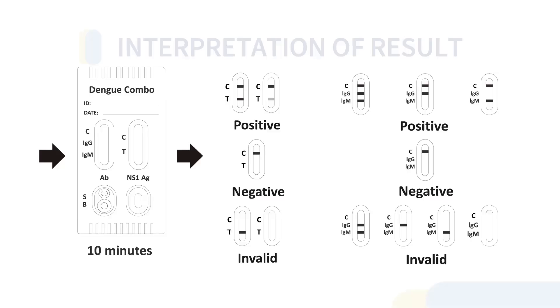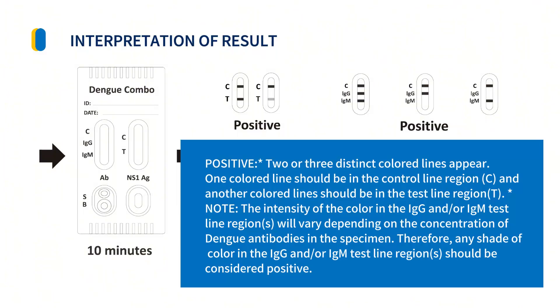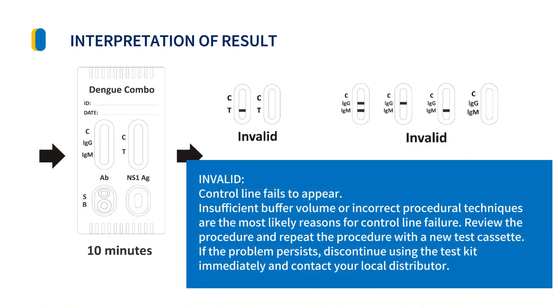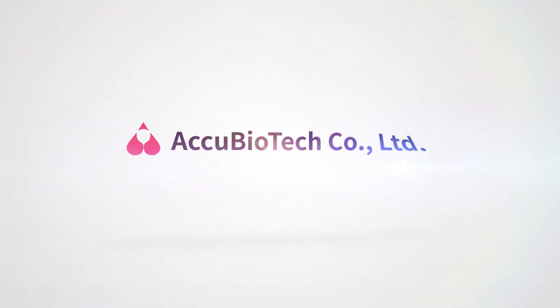Interpretation of Results: For a positive result, two or three distinct colored lines appear — one colored line in the control line region (C) and another in the test line region (T). For a negative result, one colored line should appear in the control line region (C), with no lines in the test line regions. For an invalid result, the control line fails to appear.